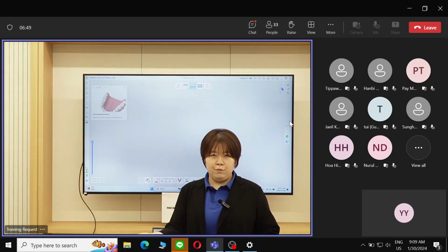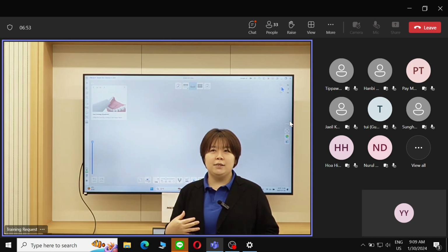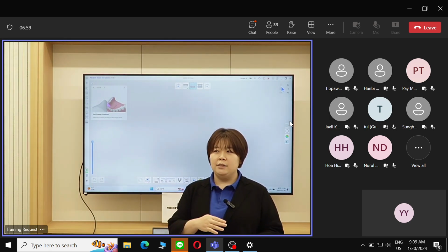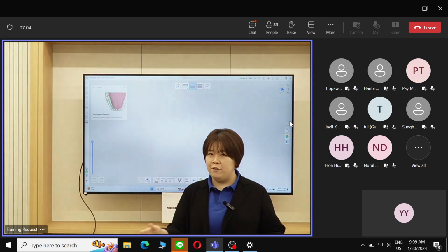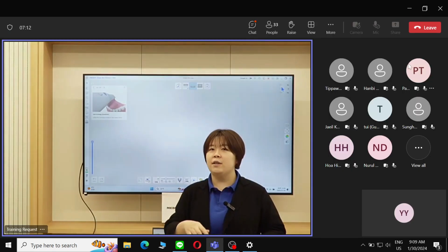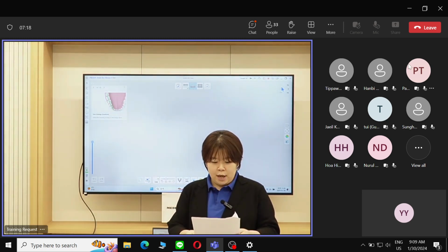I hope you're always mindful of MEDIT's vision, MEDIT's commitment to providing the best software and the best updates to all of our users free of charge, meaning they can use the old scanner, they can use their same old PC, and just by upgrading the software, they will be able to experience a totally different scanning experience.